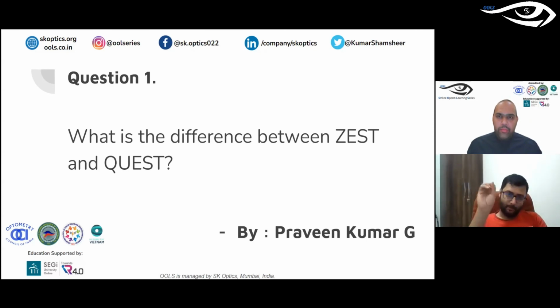Instead of showing the mean of the prior probability mass function, if you show the mode of the prior probability mass function and then do it, that becomes the QUEST test procedure. That's the main difference, and otherwise it follows the same thing. Instead of presenting the mean, you go with the mode first.